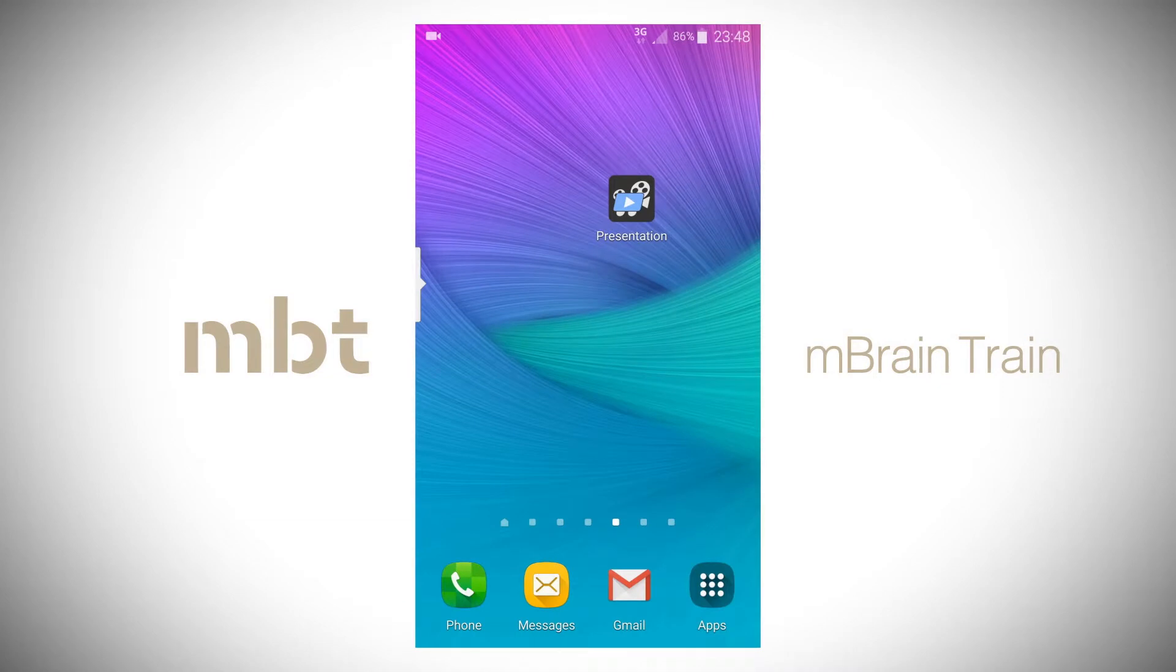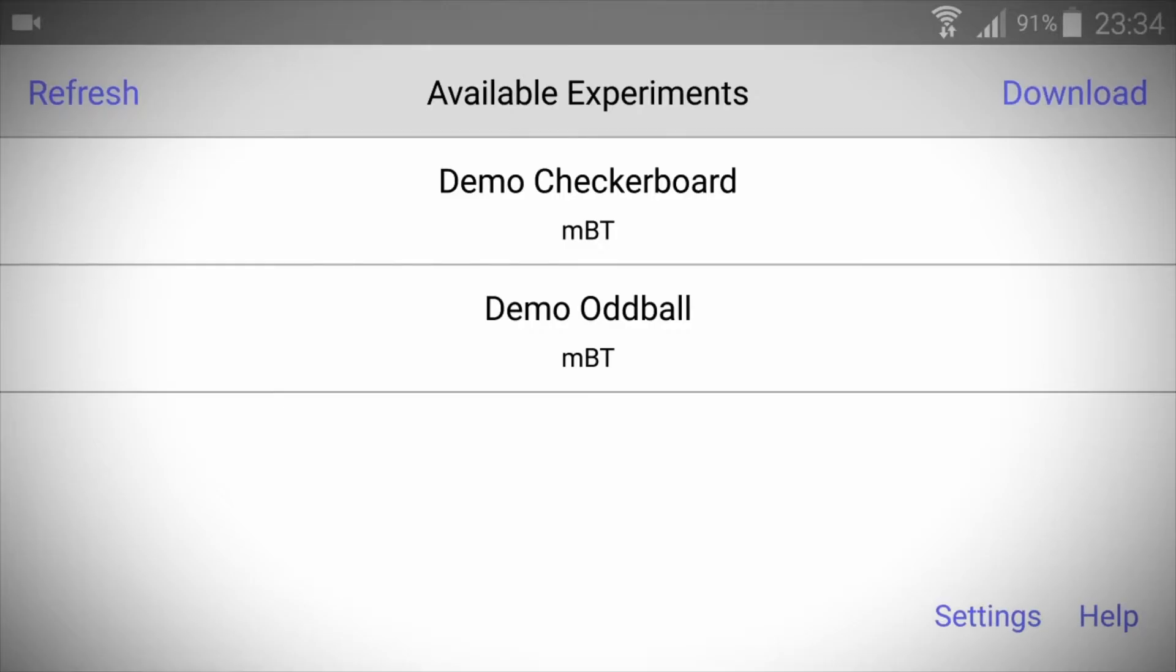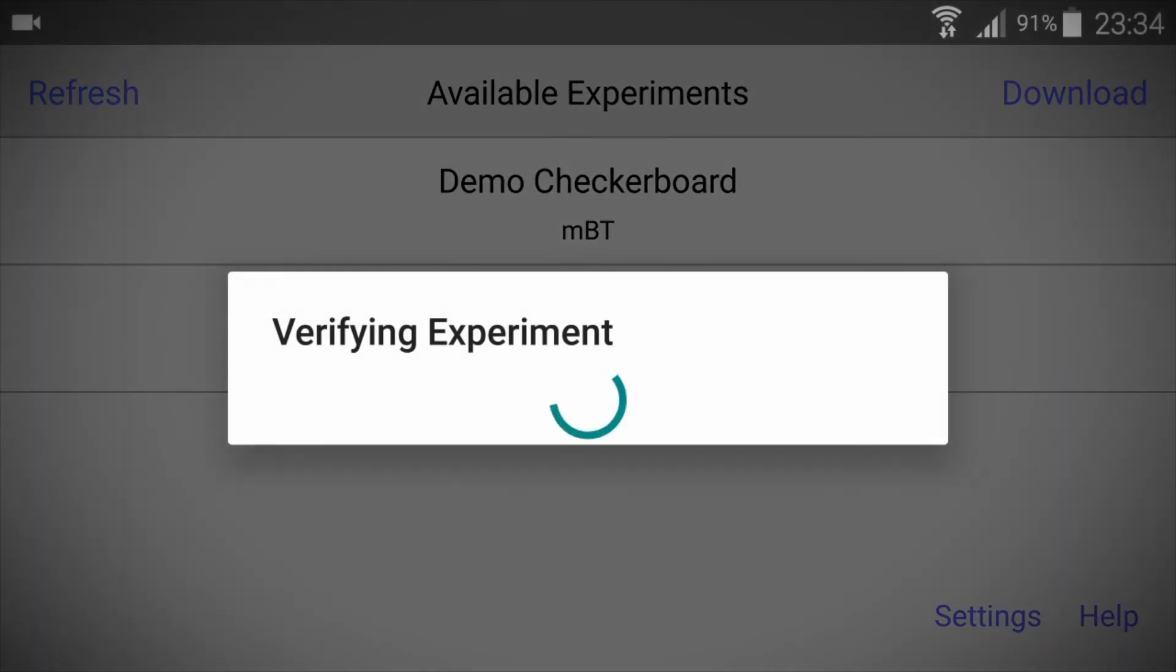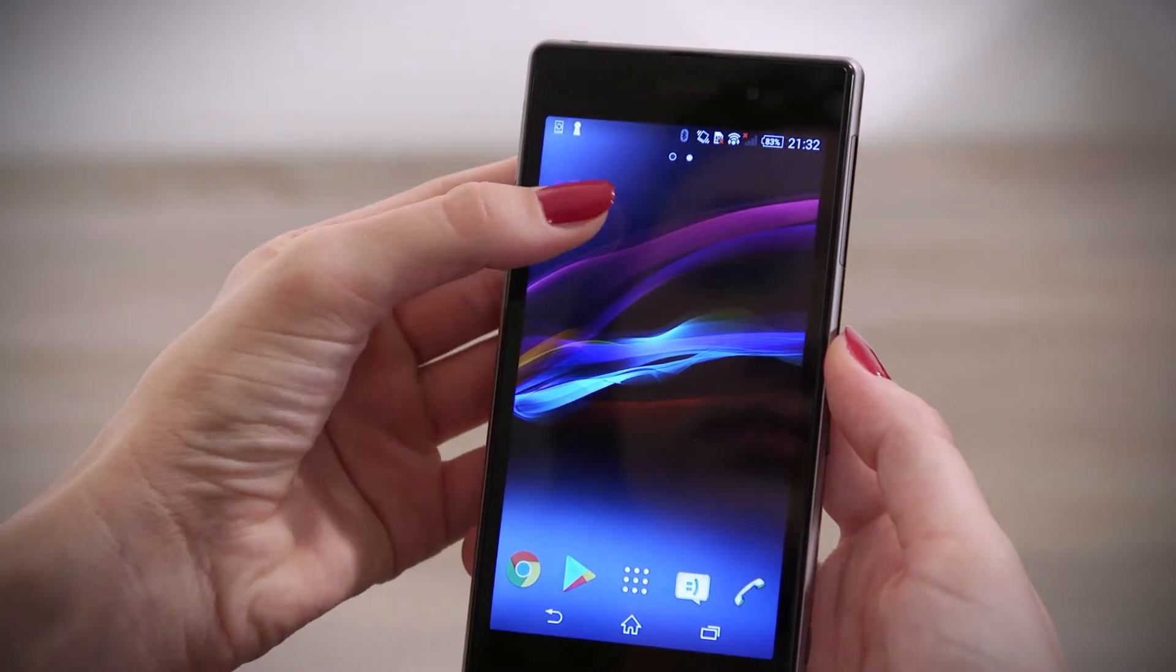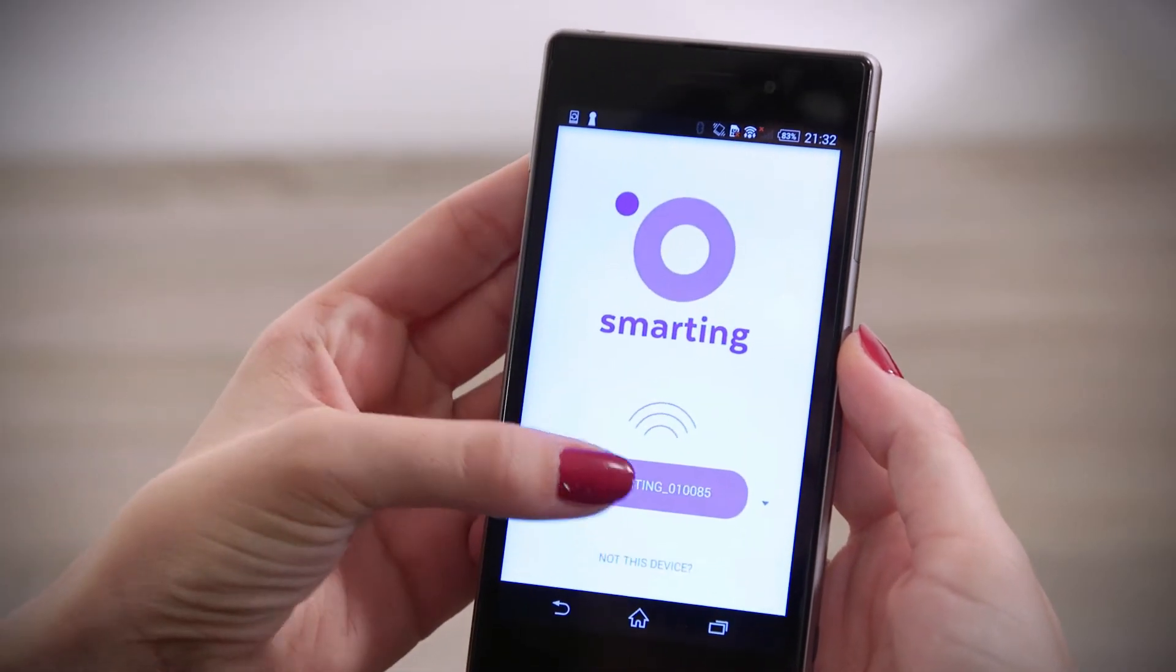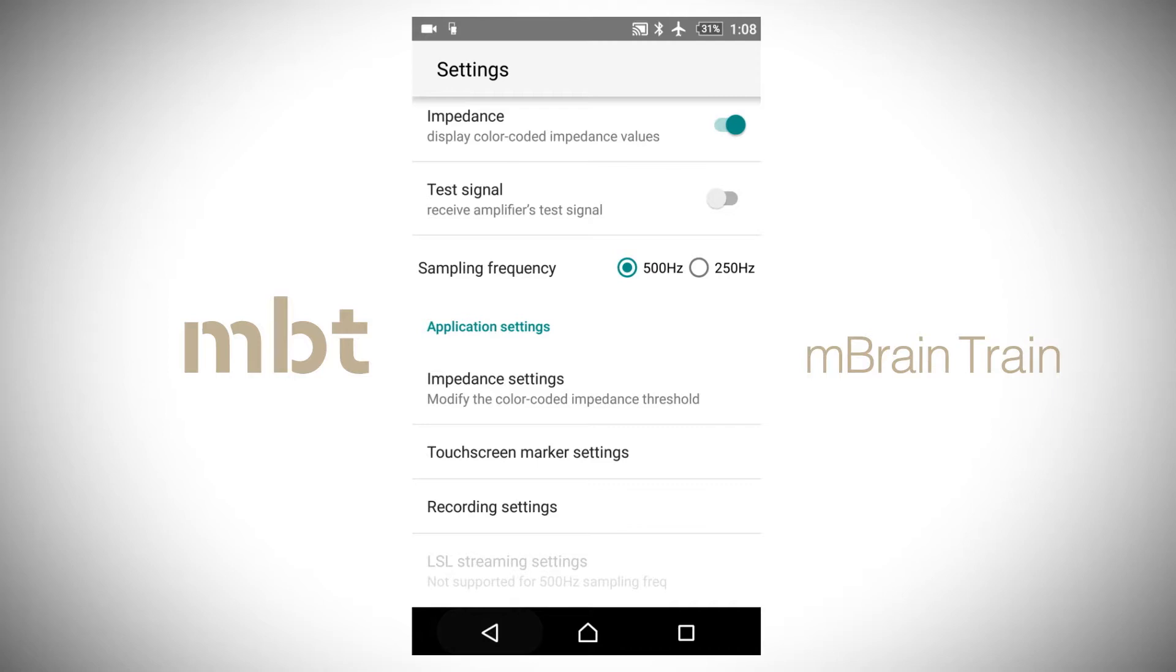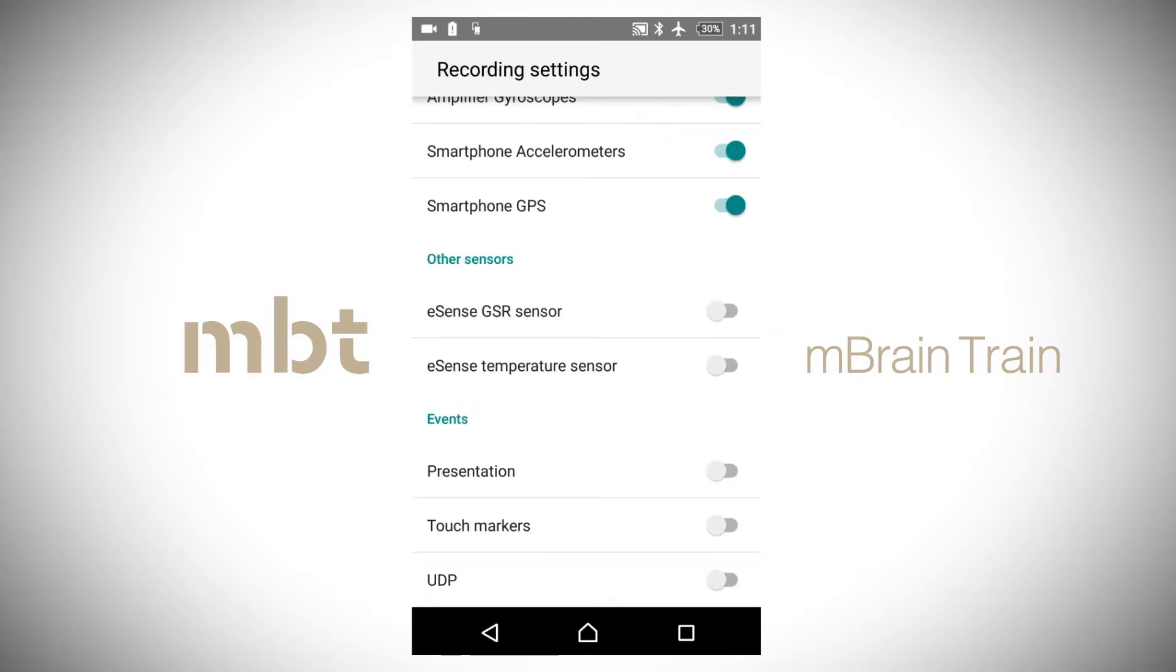Open the presentation app and select the desired experiment scenario. We will use the checkerboard demo that comes pre-installed with our system. Open the Smarting app and connect to the Smarting EEG system. Go to Settings and enter the recording settings. Select the XDF file format and enable Presentation from the Events menu.